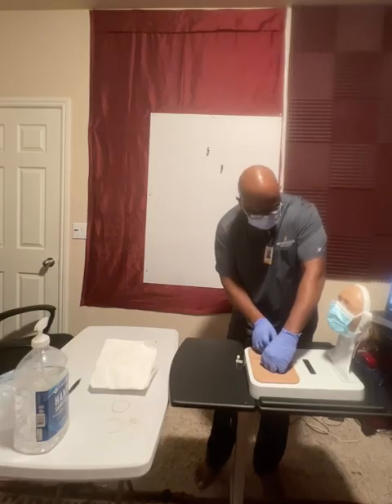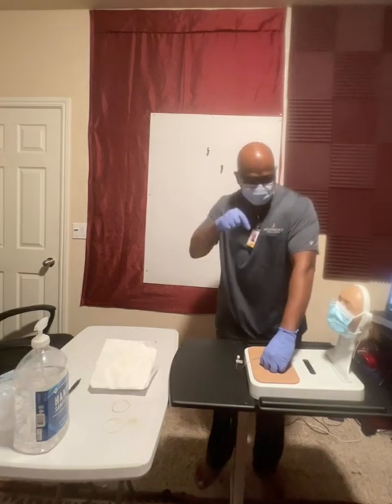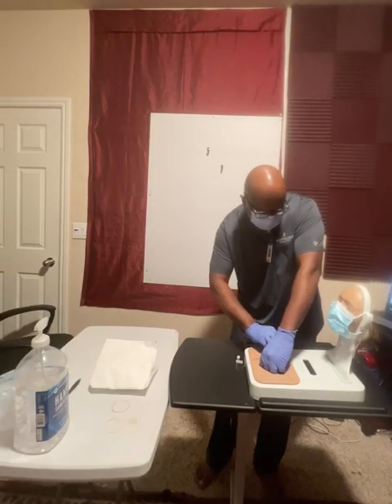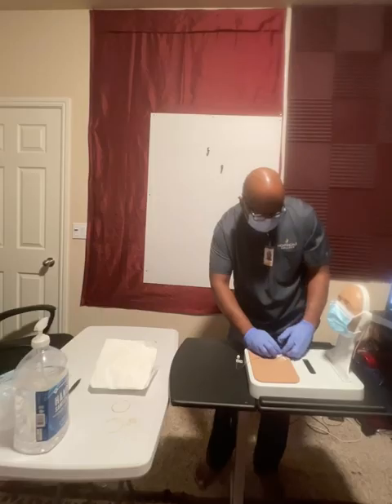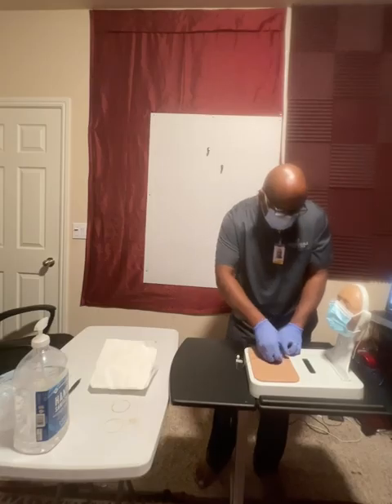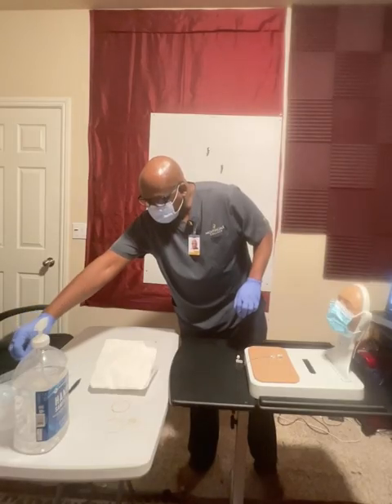Now when I pull up this dressing, it's important that I'm doing the corners first. I'm going to be lifting up, pulling up and inward towards the site, right? We want to make sure we get the edges first, up and inward towards the site, parallel to the skin. Making sure we're stabilizing that catheter though. That's very important as we're pulling this up and inward towards the site. Right, good, got that off. Let's get rid of that one there.